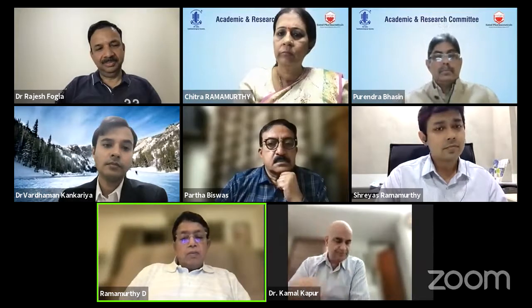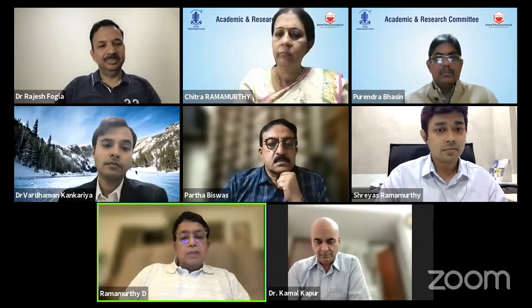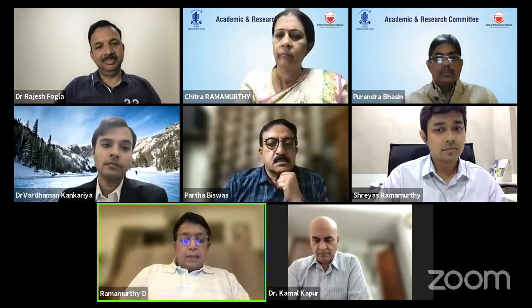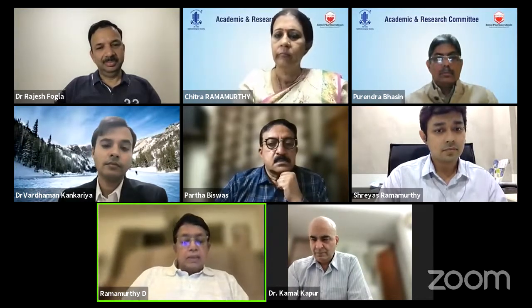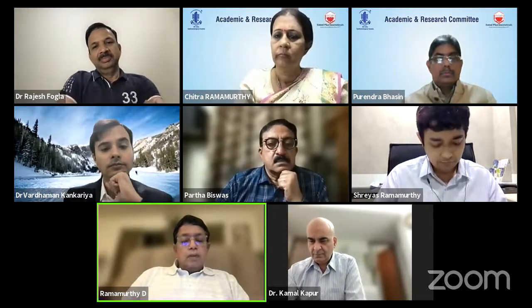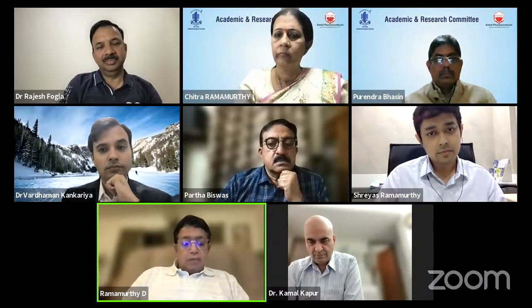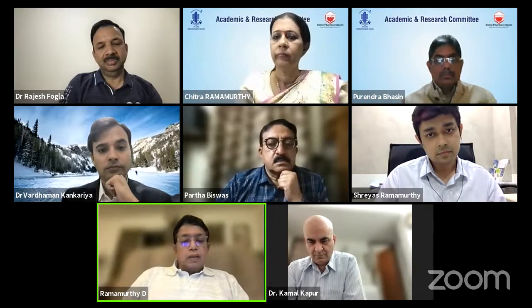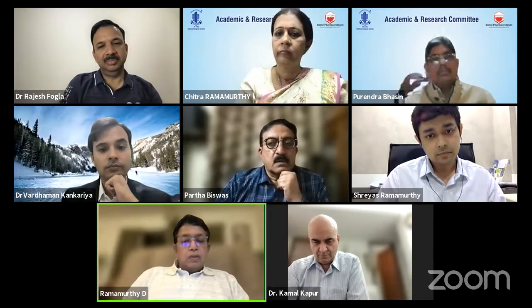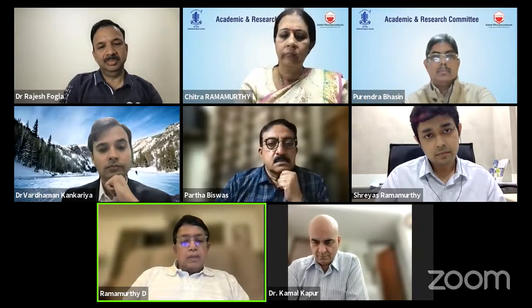What we want with our actual measurement is mid-limbus to mid-limbus. Practically, of course, Shreyas has done a detailed study, but what we do is use either a Topolyser, a Pentacam or a Shreyas device, depending on what is available at the center. Make digital calipers the basic instrument, get the measurement and compare the two.